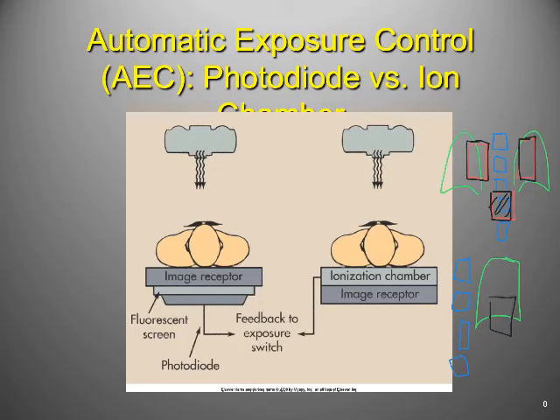Okay? But one thing you could do potentially in your clinical rotations right now is start to ask them, hey, will you point out to me how you're positioning the ion chambers for automatic exposure control? Whenever you're using the AEC or the photo timer, will you show me where the pattern set is in the preset so I can see what that triad pattern is, and I can start to think about how the anatomy is over those ion chambers? They will show you it. It's a big part of what they're doing. Okay?